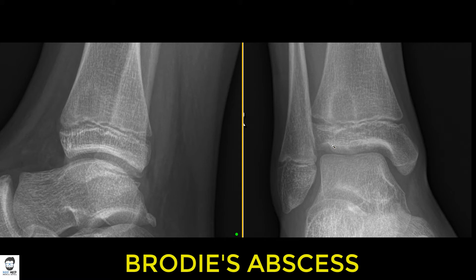MRI gives a picture of the soft tissues around the lesion and provides better assessment of how the lesion behaves. You can see how the soft tissues are responding to the lesion, which helps differentiate whether it's an infection, a malignancy, or something else. Let's have a look at the MRI for this child.